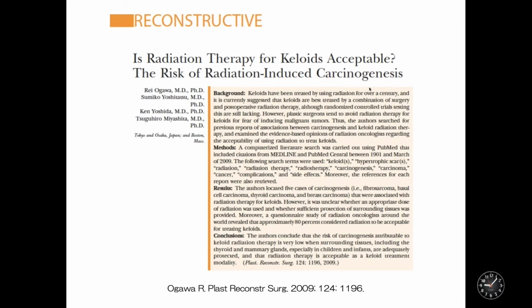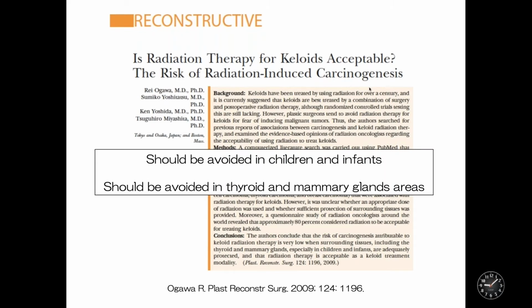Also, we have discussed the risk and the side effect of radiotherapy for keloids. In conclusion, we have concluded we should avoid it in children and infants, and we should avoid it in thyroid and mammary glands area.